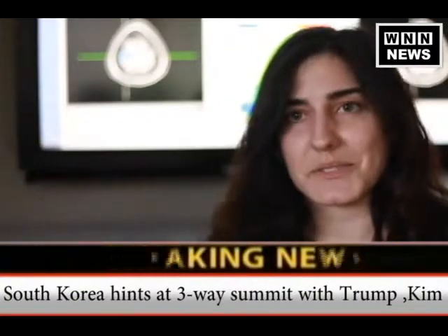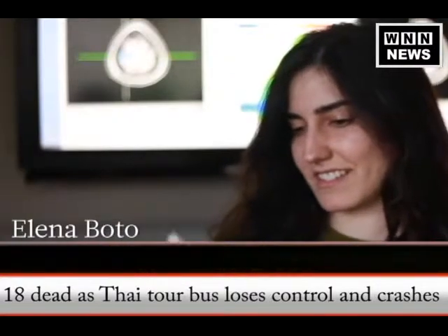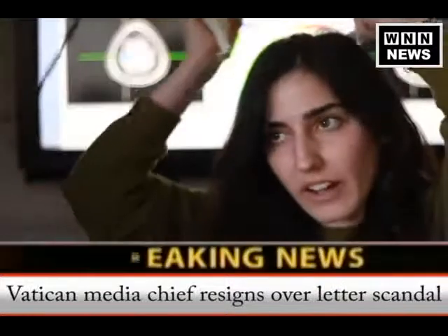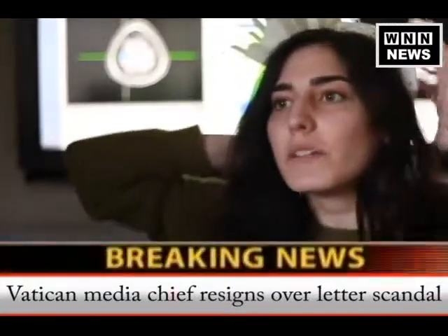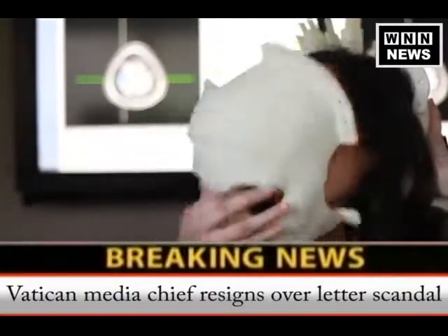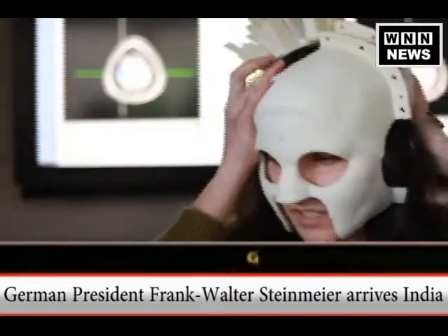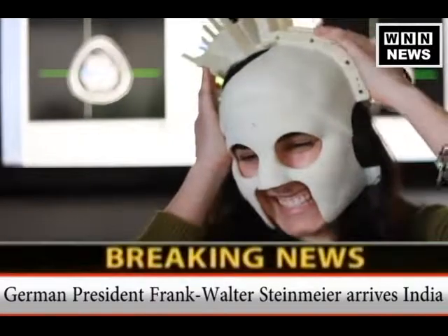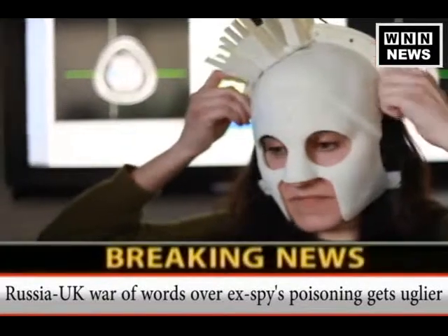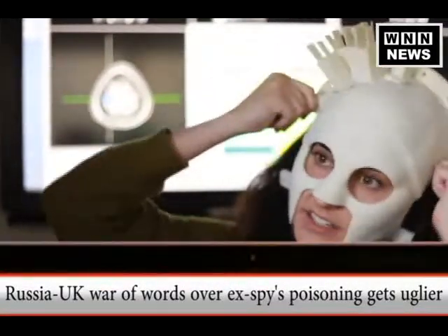I volunteered to be that subject, and yeah, so this helmet accommodates 13 sensors which are over the motor region, the right motor region of my brain, and putting it all together, it just fits. Is it comfortable? Yeah, so it fits perfectly in my head.